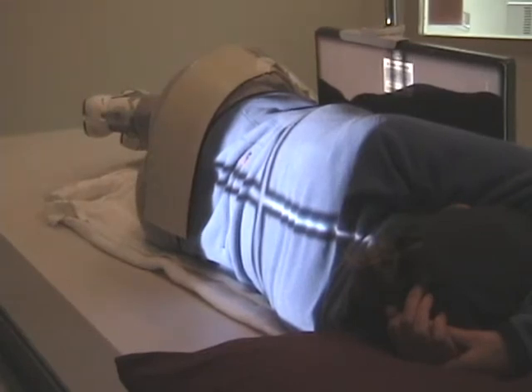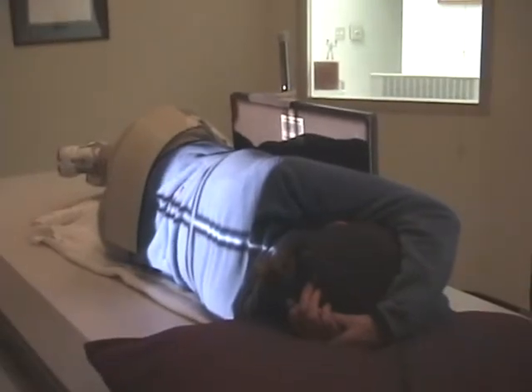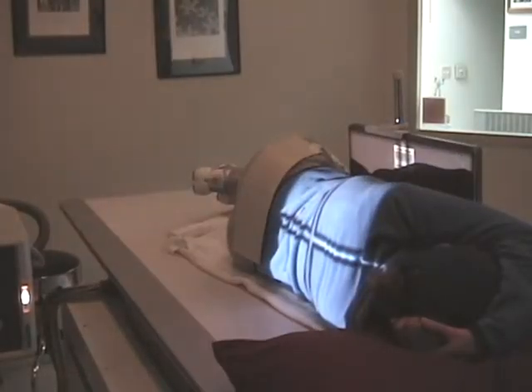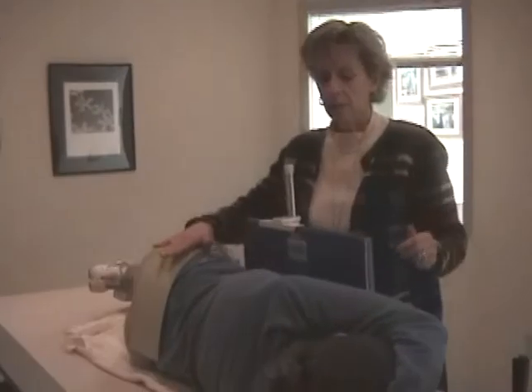Collimation is within the film's edge, right here, and lower. And the trick that you can use to make sure you're not too wide, if you see light on the wall, you have too wide of collimation. So bring it down. Okay. I've got her shielded because I am protecting the reproductive organs. And positioning-wise, I have everything set up that I would need to do.